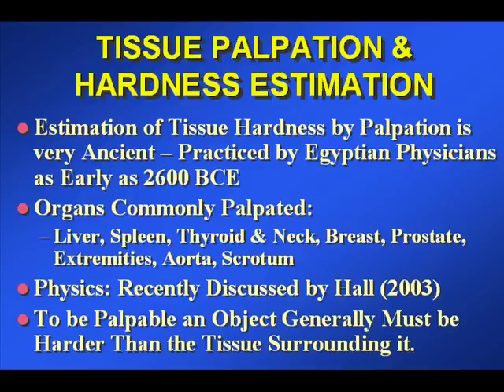The physics of palpation have been recently reviewed, at least briefly, by Timothy Hall in 2003. To be palpable, it's easy to think of it as an object simply must be harder than the tissue surrounding it. Otherwise, you won't be able to feel it.